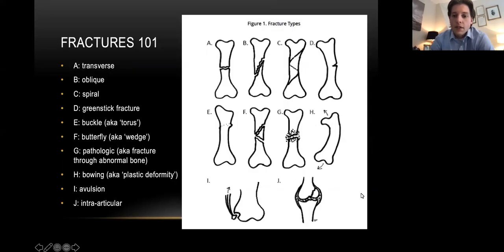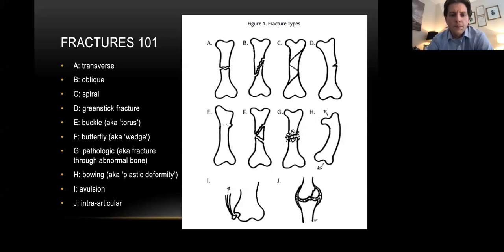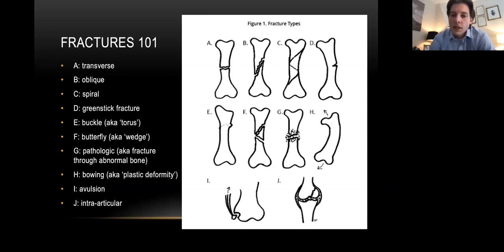Now let's actually start describing types of fractures. There are lots of different kinds — you don't need to learn all of these, but hopefully you'll remember a couple. If you're a first or second year, the top-line ones would be great; if you're a third or fourth year, try to learn a few more. Fractures don't always fit exactly into one pattern, but often they do, and it's worth describing the pattern you think you're seeing.